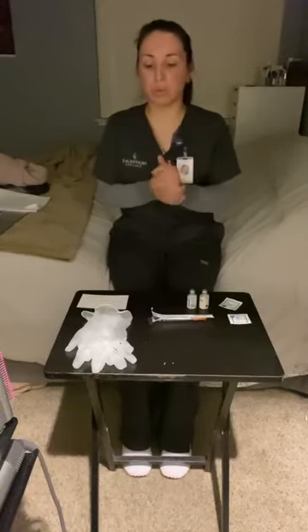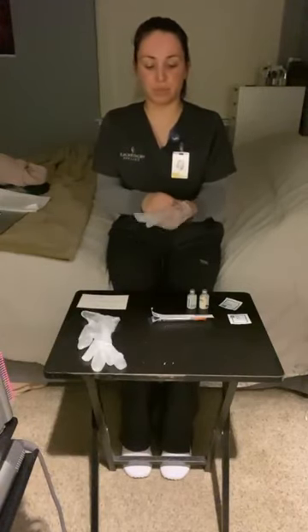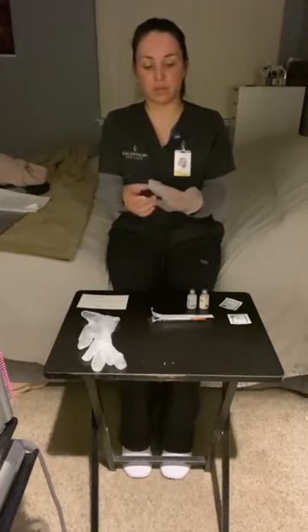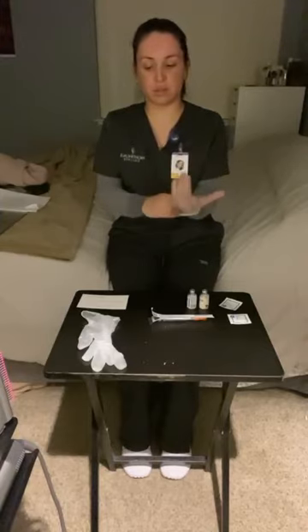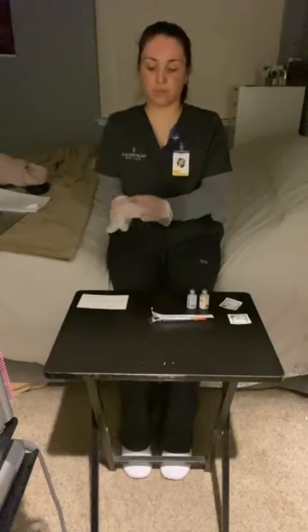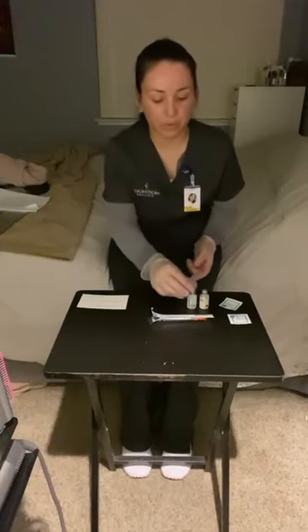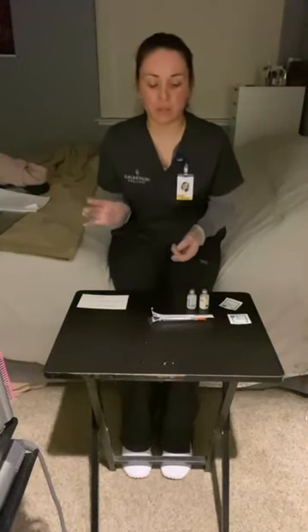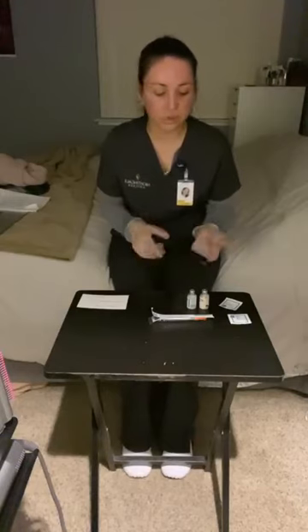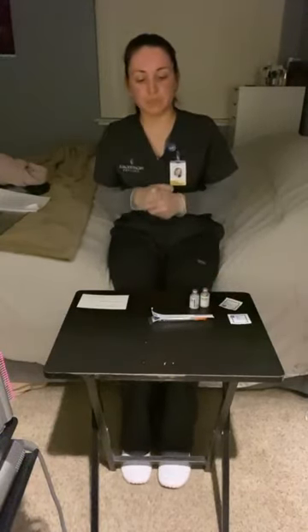Okay, so I would perform hand hygiene. I'm going to go ahead and put my gloves on. I would gather my insulin vials from the medication cart. I'm going to compare the labels with the MAR. I'm going to check the expiration date. I'm also going to inspect for any altered color. I would make my dosing calculations here.